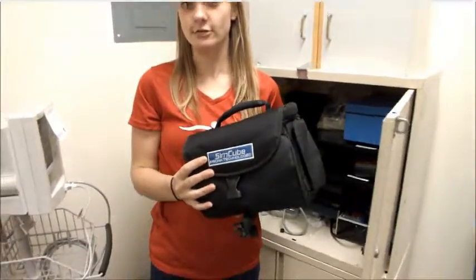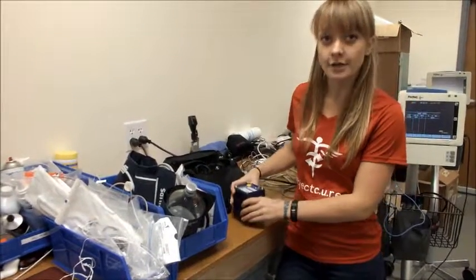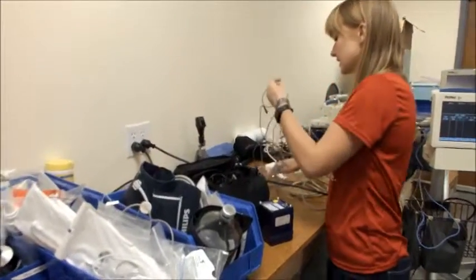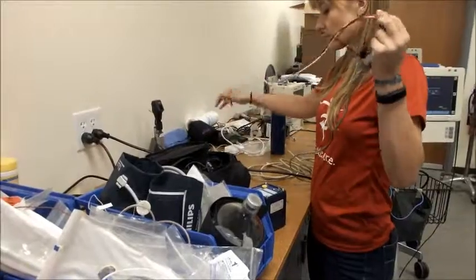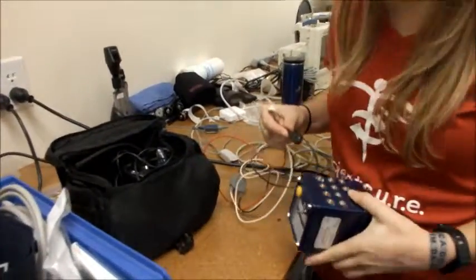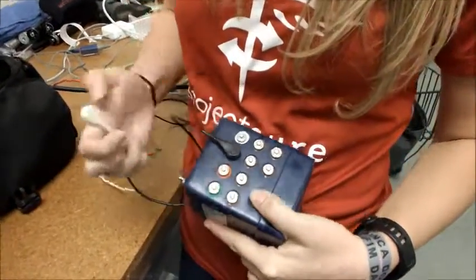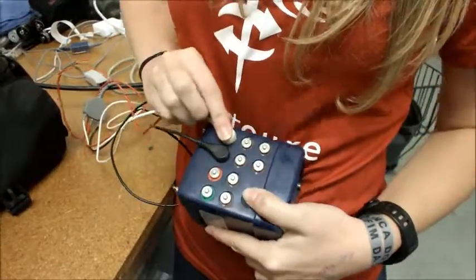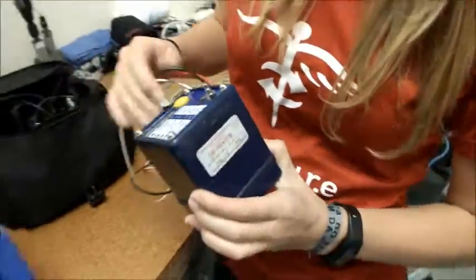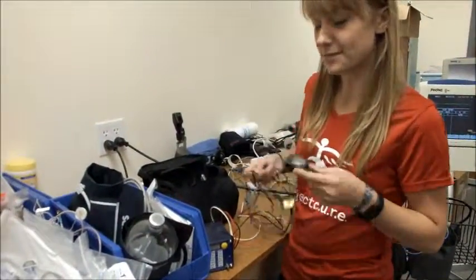Now you're ready to go. The SimCube is used to test blood pressure and heart rate on your EKG machine. On the side of the SimCube you'll see plugs with different colors. You need to connect your electrode cord to each of the corresponding colors on the side of the SimCube. You're also going to need to plug the SimCube in.